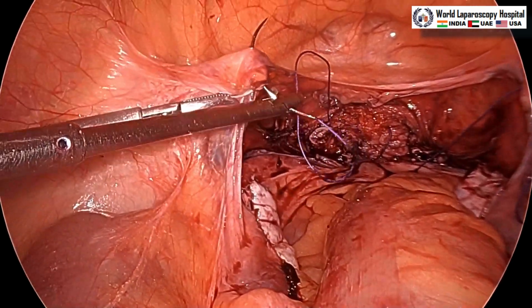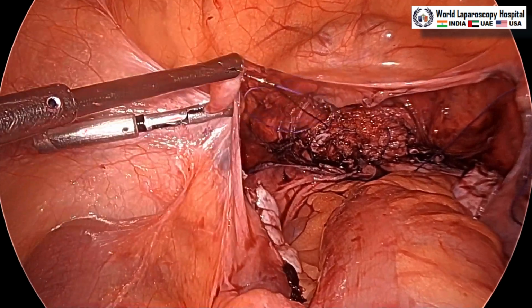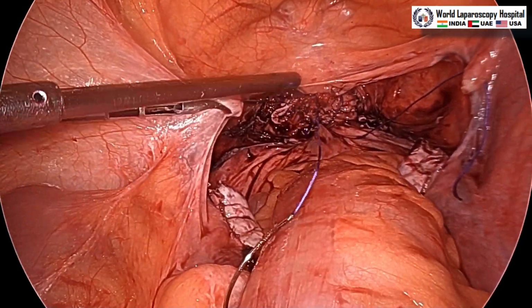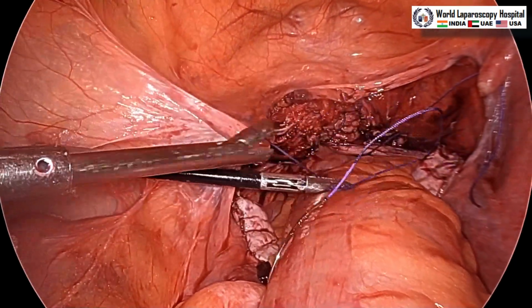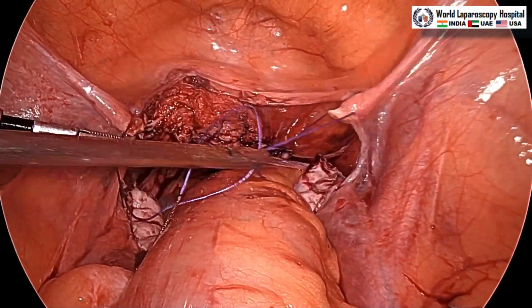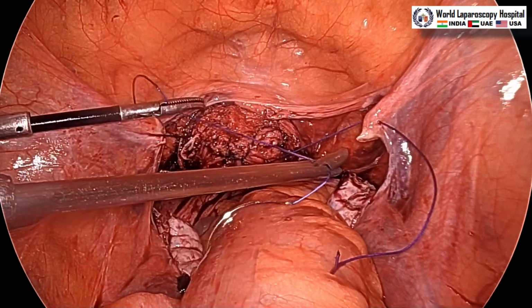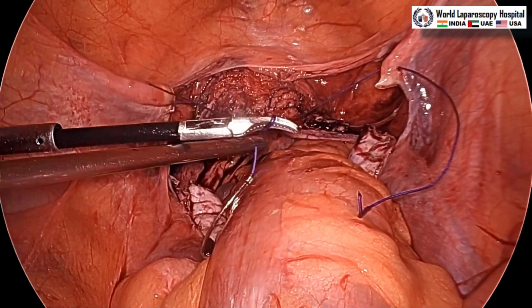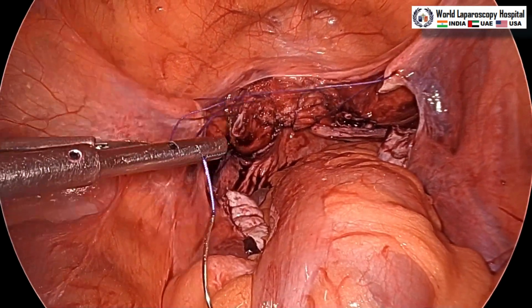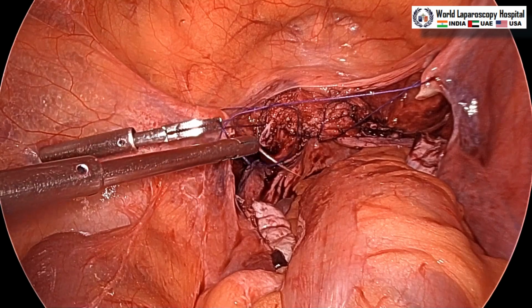Now, this is the left round ligament, and then the needle end of the thread and the tail end of the thread both will be pulled. This is the needle end and here both are pulled. You can see the vault is suspended now, and here we are using a tumble square knot. The tumble square knot has the advantage that if you have a suture under tension, you can still slide it better. So, initially you have to keep the suture loose, and once you make a square knot, then you can tumble one of the limbs and you can slide it.